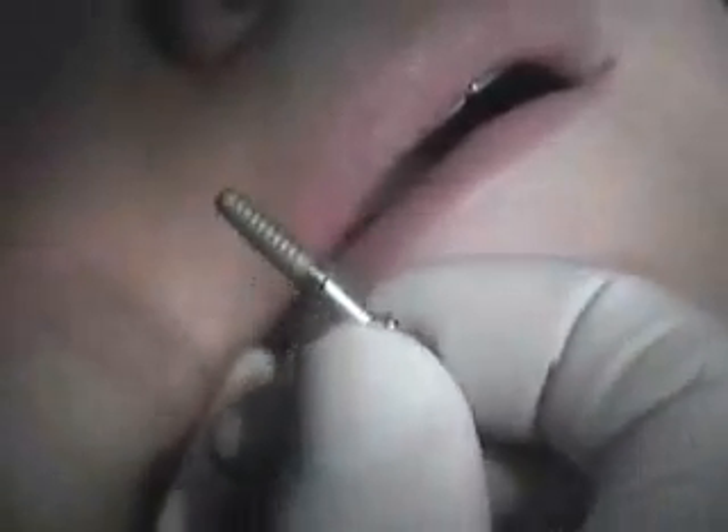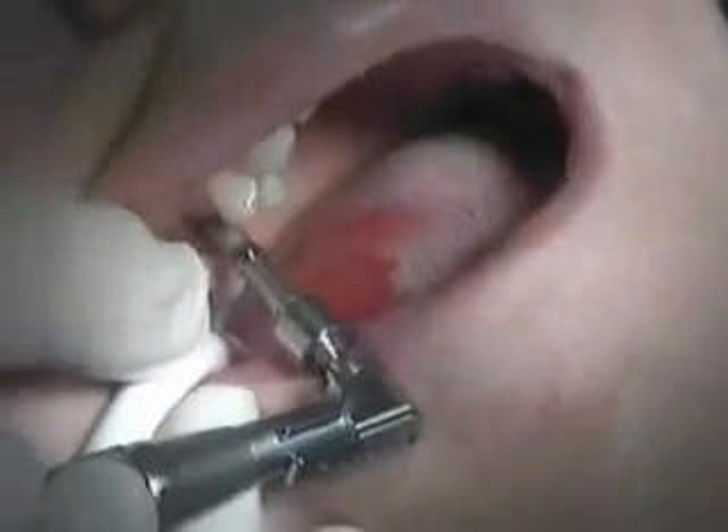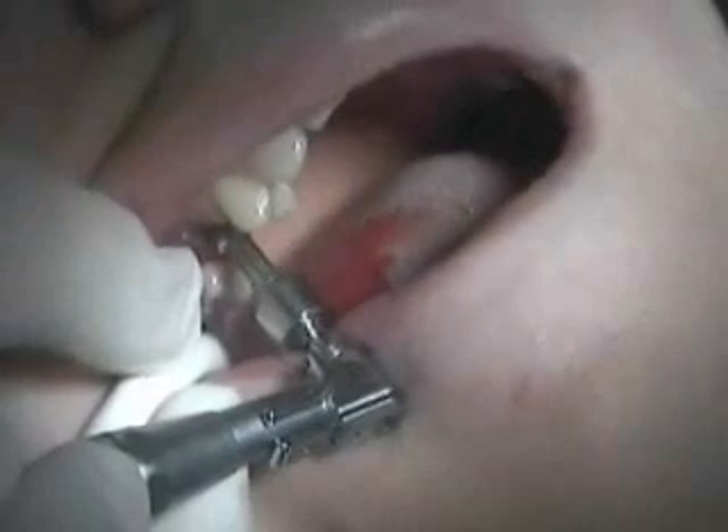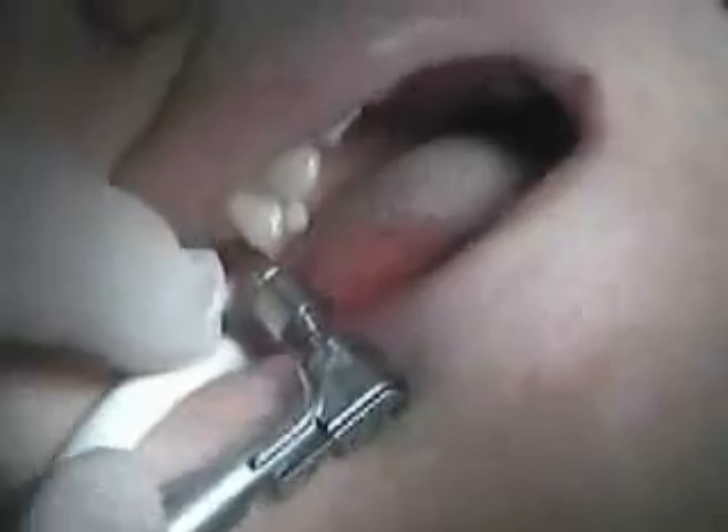The depth that we want to go to — and we went to a 3.5. Now we're loading an implant, a 4.1 by 12 implant, with a insertion device called the J driver. We're then going to go ahead and place it into a handpiece and drive the implant home with the slow-speed device.